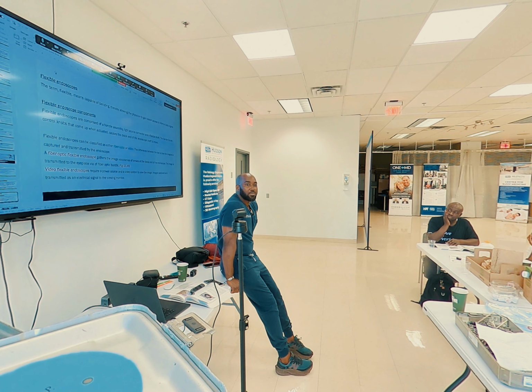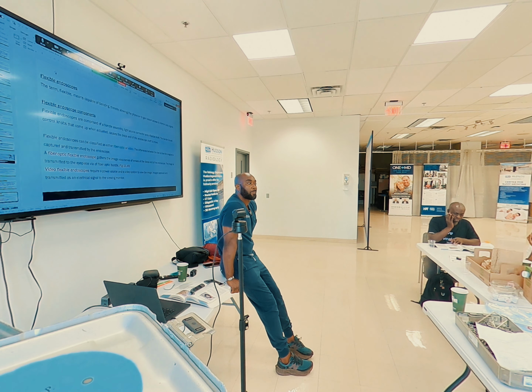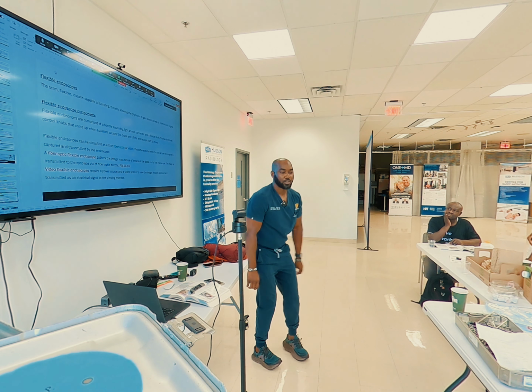What is the minimum required treatment when it comes to high-level disinfection or sterilization for semi-critical devices? Sterilization. Minimum requirement, not maximum requirement. The minimum class requirement. Two, classification number two.